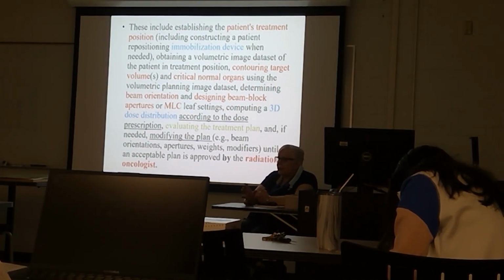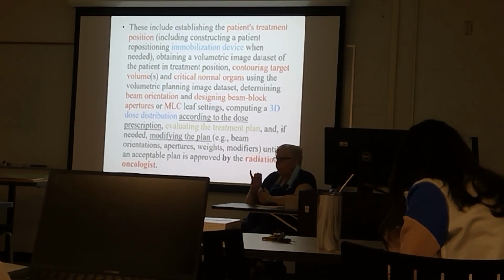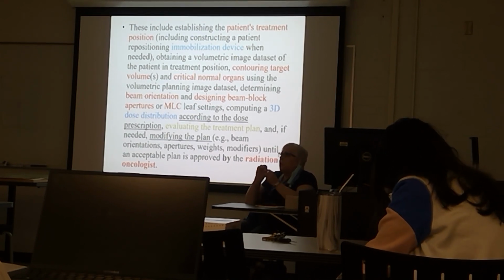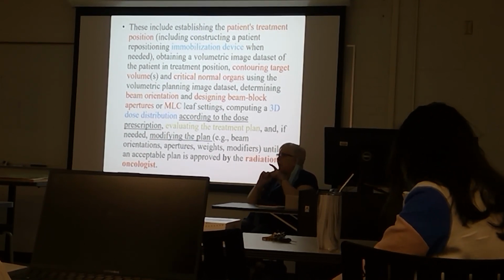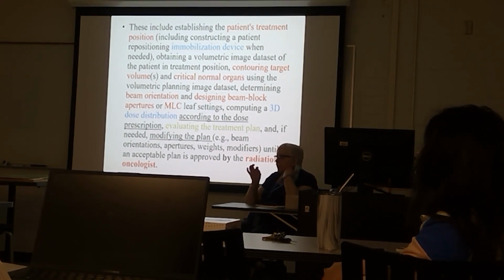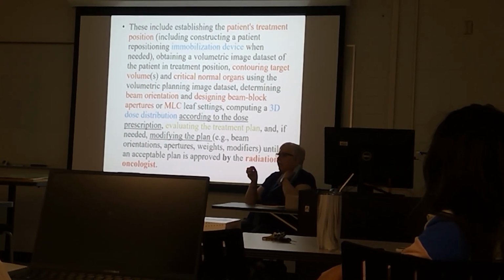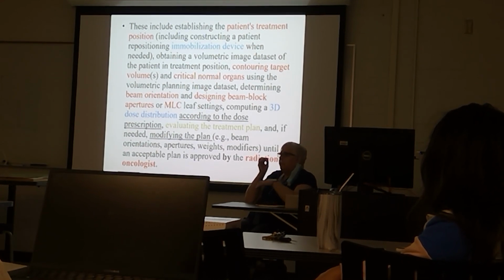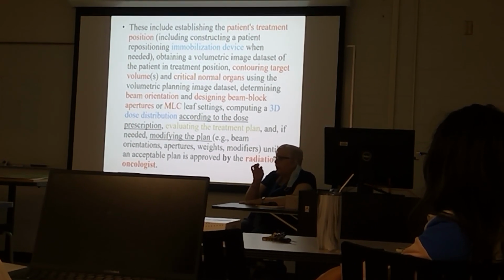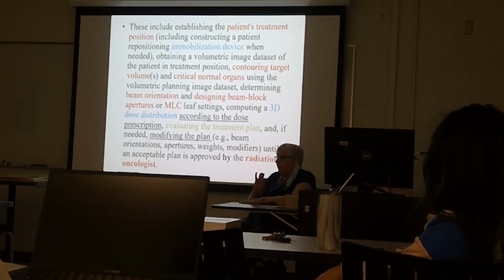CBCT is meant to position soft tissue. Especially for prostate, some prostate patients will have prostate beads. They're there to position.